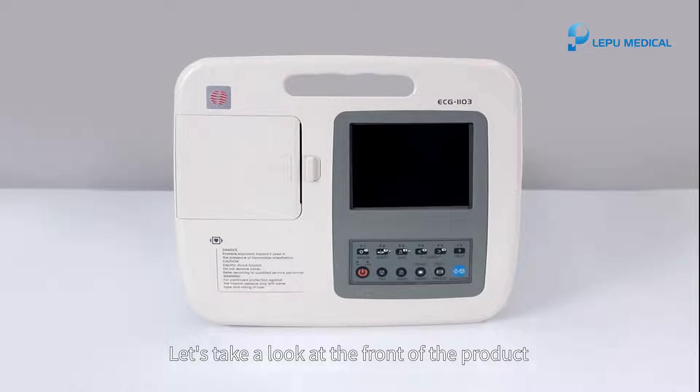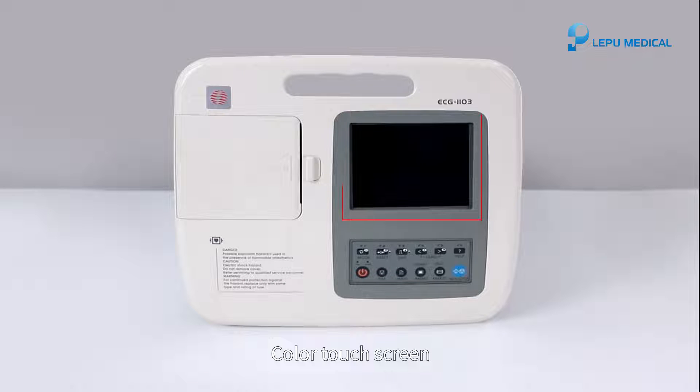Let's take a look at the front of the product. Handle. Color touchscreen. Keypad. Thermal printer.